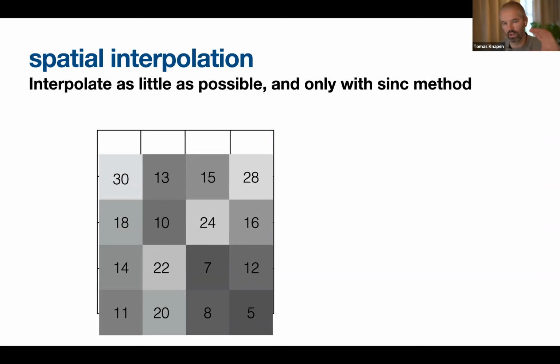So we still want to have the same number of voxels in all directions, right? And if we don't do this, we haven't actually changed the data. So we need to change the data. This means that we need to recalculate the values for each of the voxels, right? So what do we do inside this red box? One way that you can do this is by taking the average. In this case, that would mean making it the value 24. Yeah? There's a problem here.